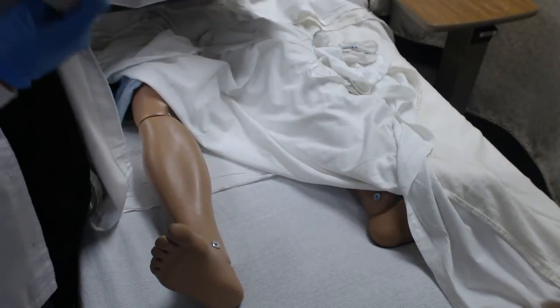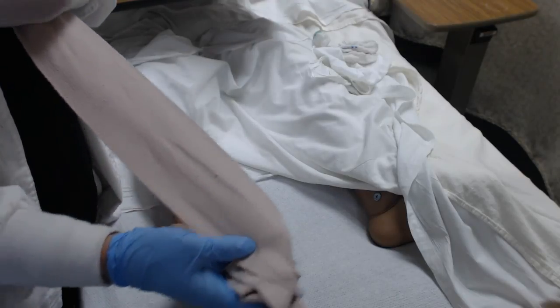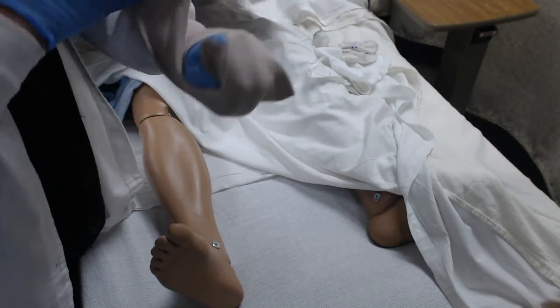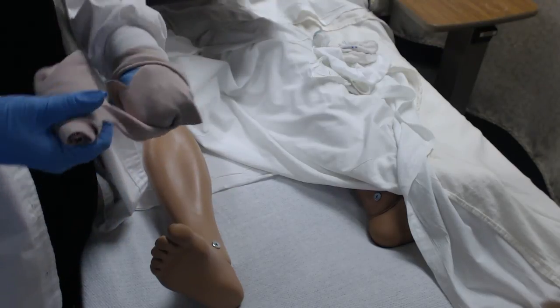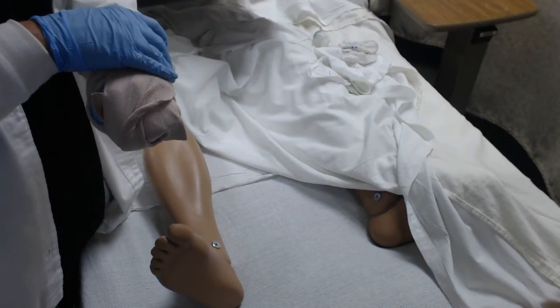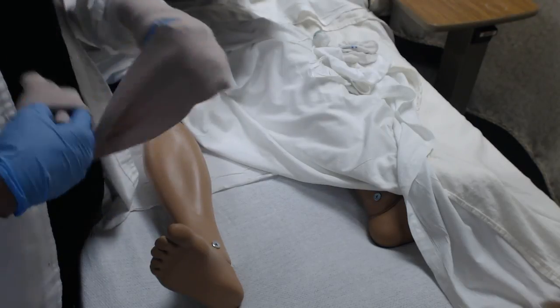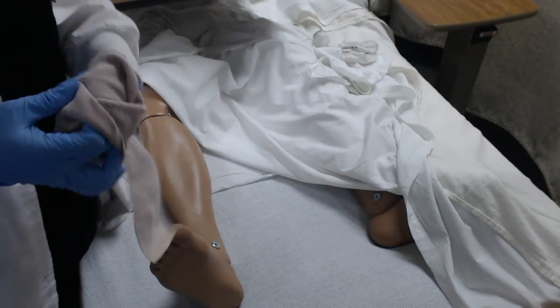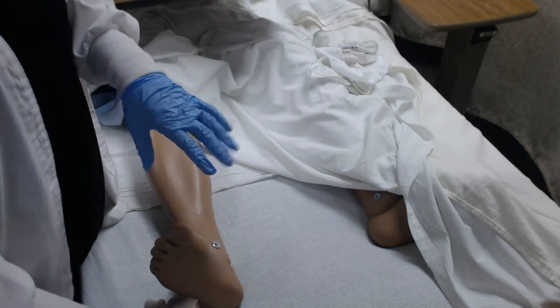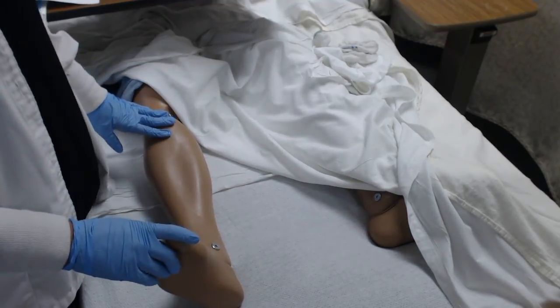It would have to be fairly tight so that the stump would then have time to recede, and it would decrease the swelling of that stump. So that would be something that you may have to wrap, especially if you're on a vascular floor.